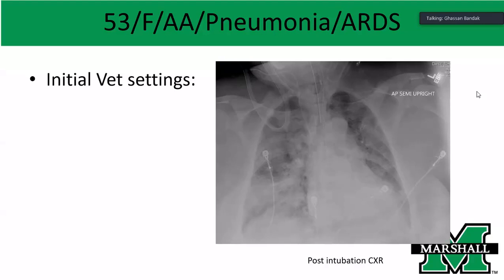Okay. And tidal volume, I mean, it depends on the body of the patients. We can start with the 450. Okay. And we can start the respiratory rate with the 20. Okay. And see the response and measure the plateau and the peak pressure. We can go higher with a PEEP.